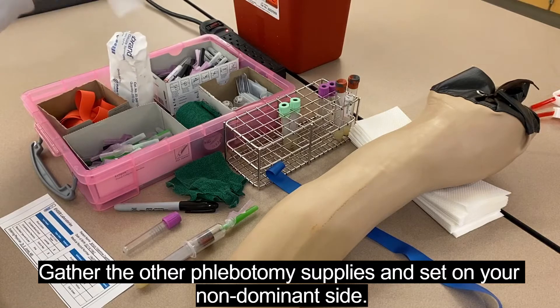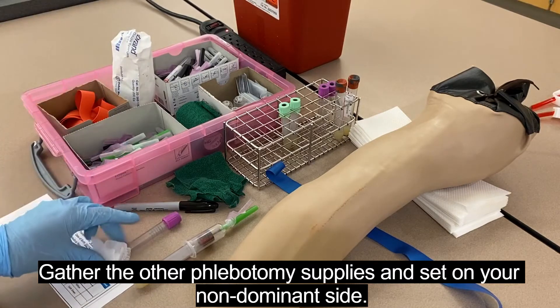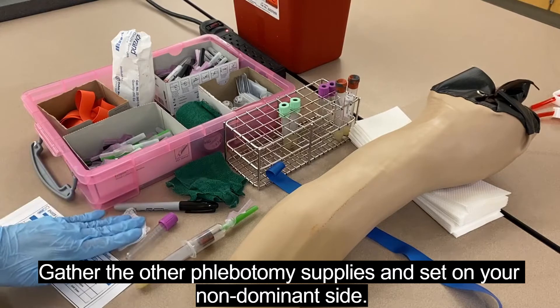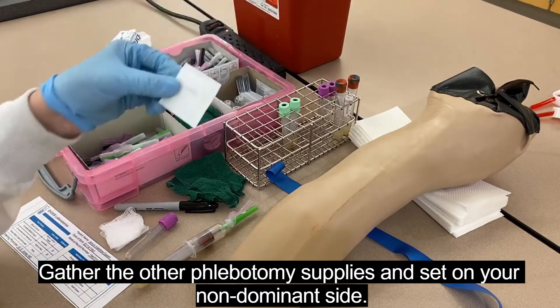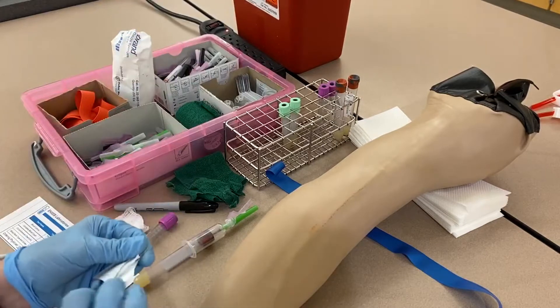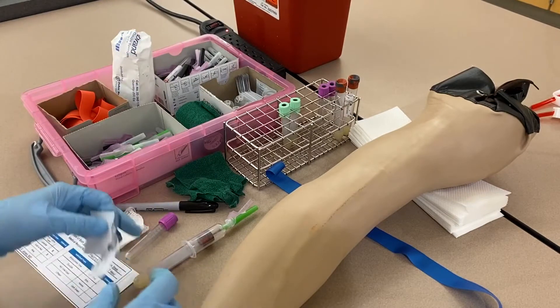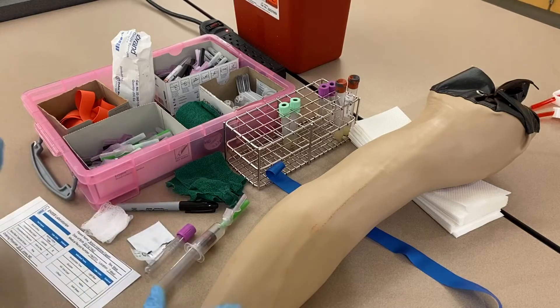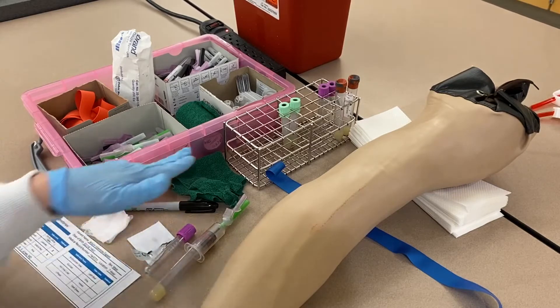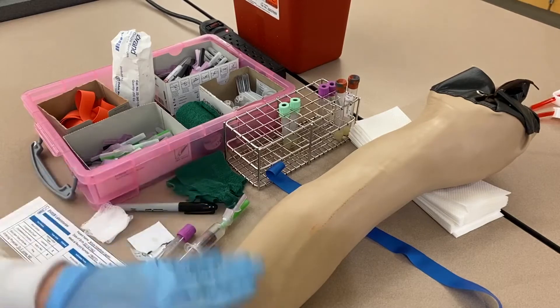People always forget the gauze, but it's next to impossible to grab or open gauze one-handed. Always have that set off to the side. Grab your alcohol so it's ready and open it up. You want everything ready to go so the tourniquet can be on for the least amount of time possible — no longer than one minute. I've also got my coban bandage ready for when we're done.